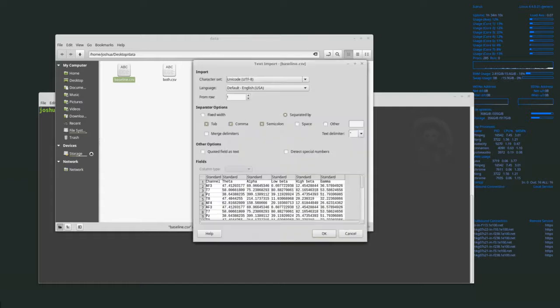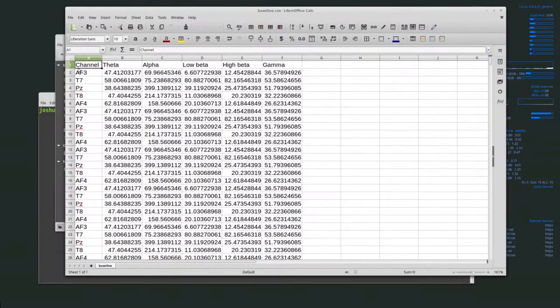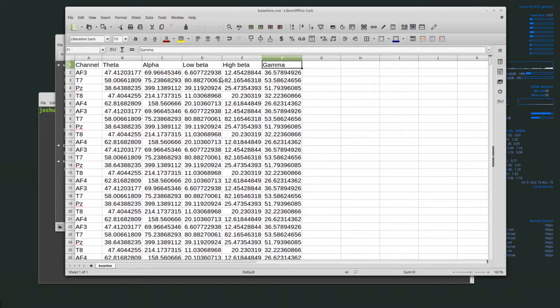If we open up baseline.csv we can see what we have here. Out of the Emotive we have the channel it was recording on. The Emotive has quite a few channels, and then we have theta, alpha, low beta, high beta, and gamma waves. The most interesting data is going to be in the low beta and high beta area.